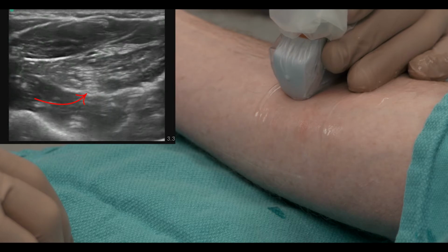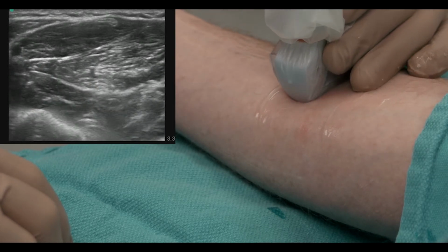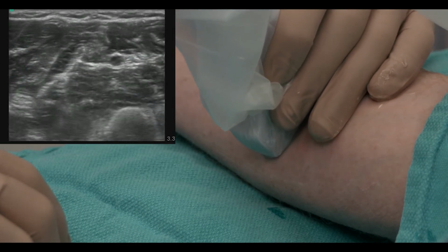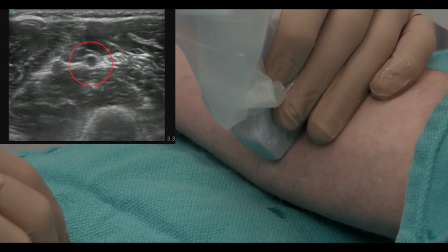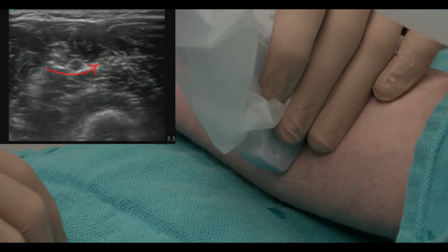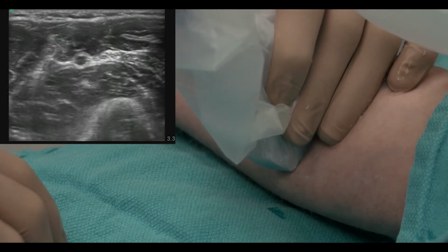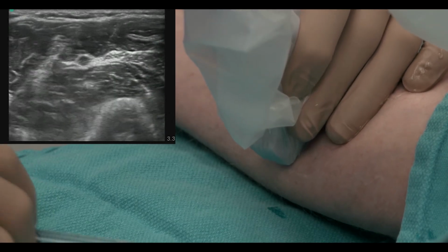Again, we have the median nerve sitting in the middle of the screen, with that honeycomb type shape sitting right in that fascial plane. From there, we're going to slide towards the ulnar artery, which now we can see is the black fluid-filled structure in the middle of the screen. If we look just screen right of that ulnar artery, so on the ulnar side of the ulnar artery, we see the ulnar nerve. As I sweep through, you can see it has again that honeycomb look to it. And again, it's sitting in the tissue plane, which makes it easy to identify.